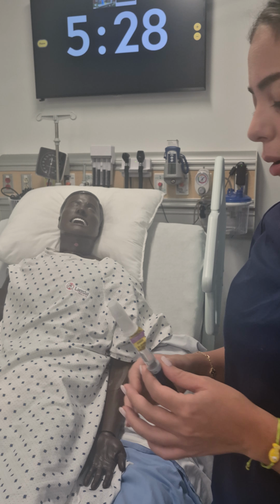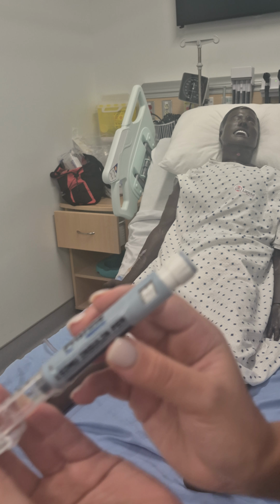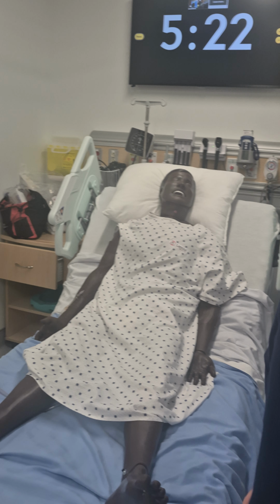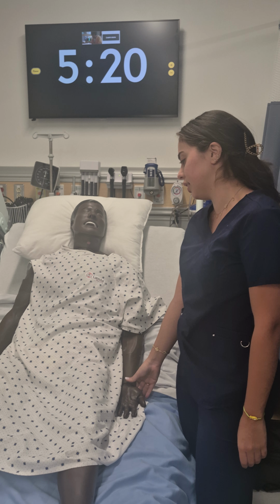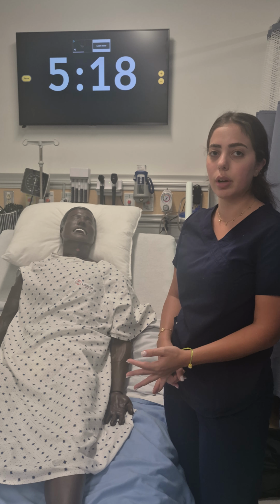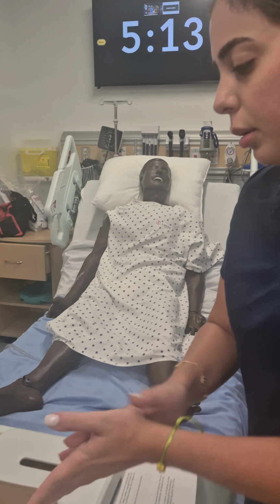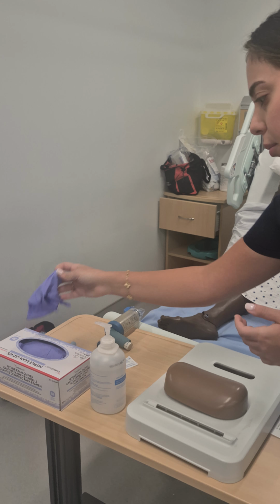Okay, perfect. In the abdomen. So I've already drawn up 10 units. Okay. I'm just going to be checking his name and his date of birth, and of course checking the right dose, right time, right order, right place, and right site. Okay, I'm going to be doing hand hygiene, putting on my gloves.